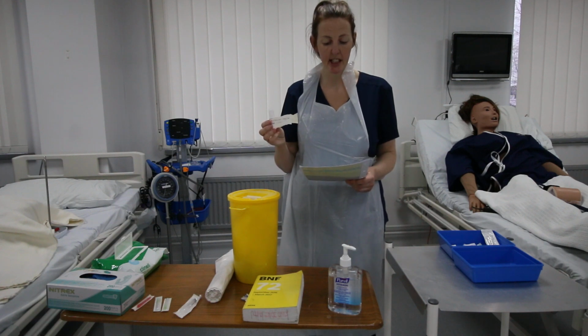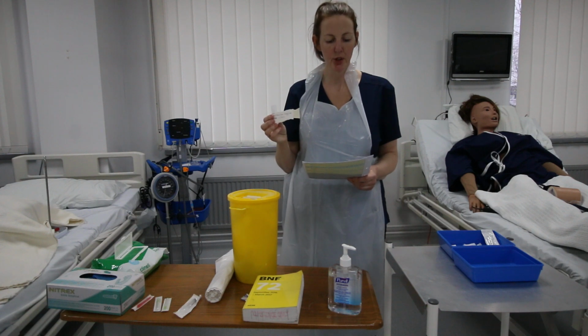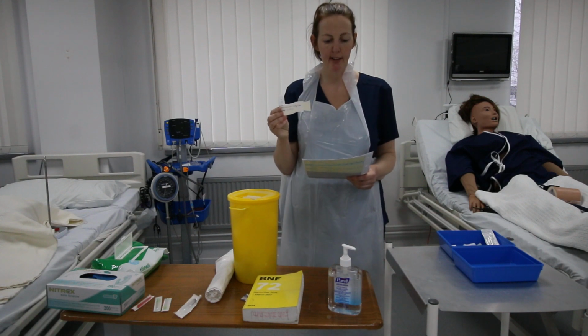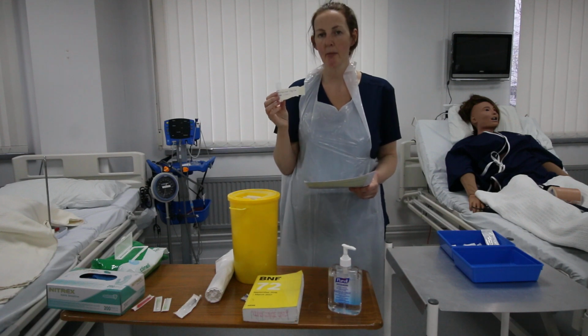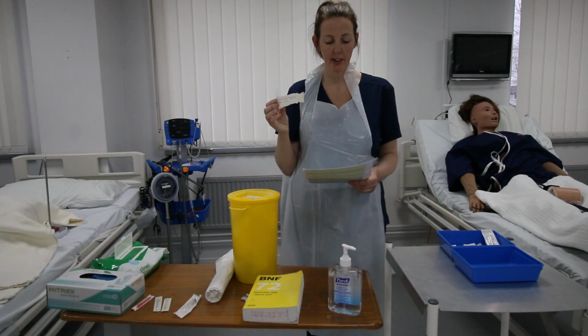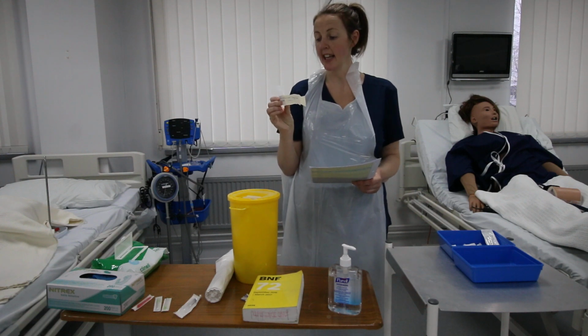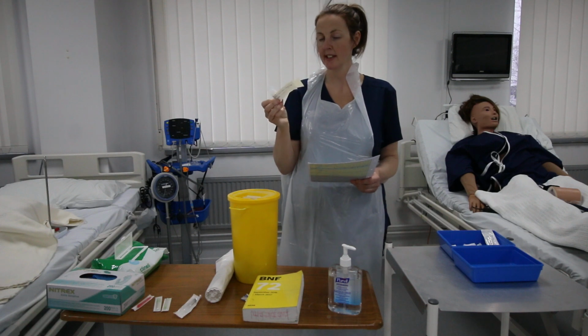The next rite of medication I have to check is if I've got the right drug. The prescribed drug here is hydroxocobalamin, or vitamin B12, it's sometimes called. And that's correct to the vial I have in my hand. The right dose is 1 milligram. I've got 10 milligrams in 10 mils, so if I draw up 1 mil, I have 1 milligram. And the route is IM. The vial I have is in date. It expires in the future and there's no precipitate. It's a nice clear vial.